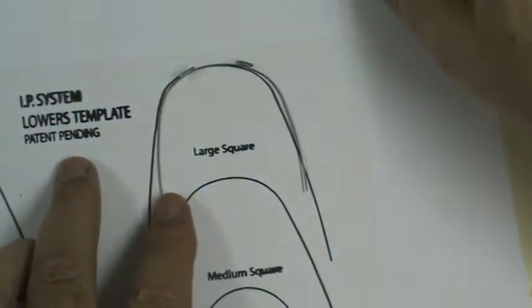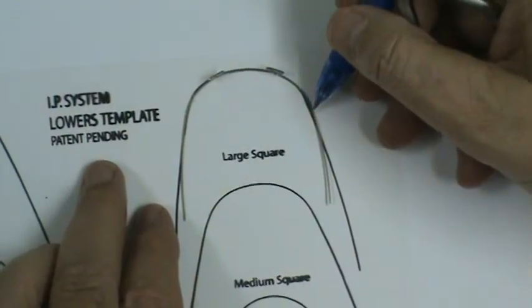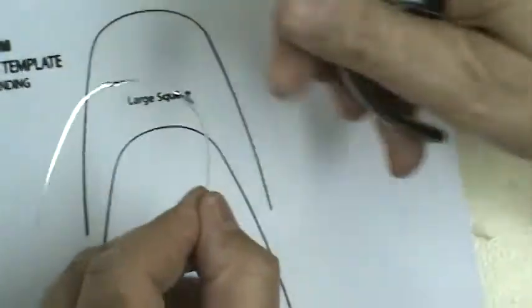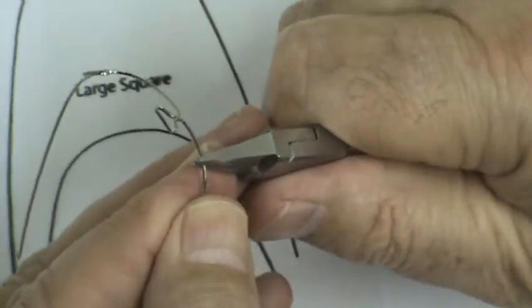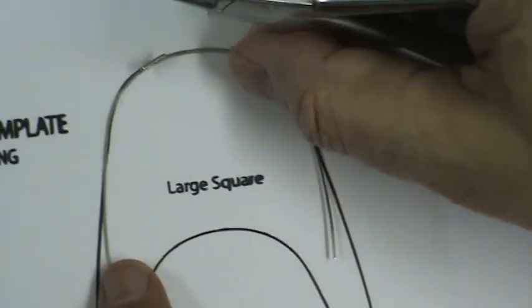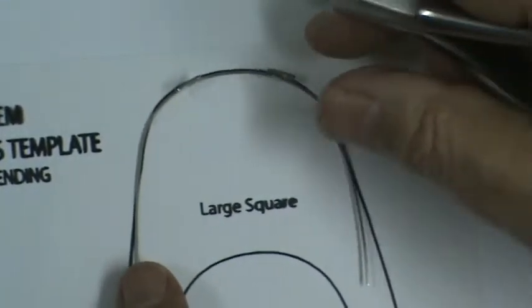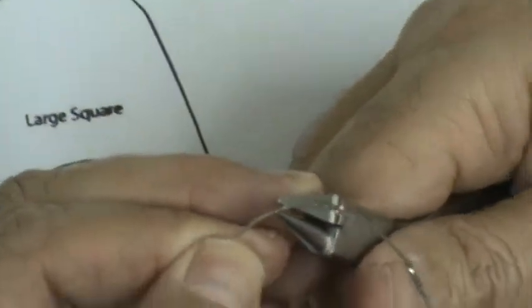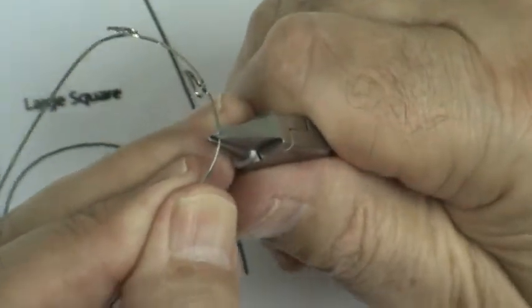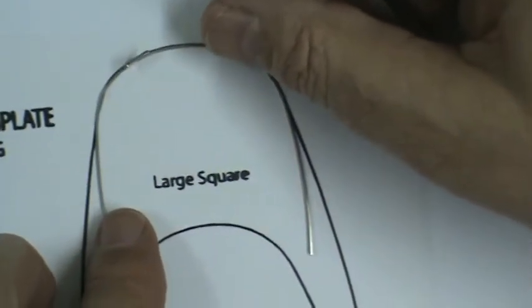Okay. I'm not really looking at the back of the wire yet, because the back of the wire is going to be inside. I'm looking right here on the side, so I need to bend in this side just a little bit more. Probably just a little bit more. The wire is going to look a little strange right now.